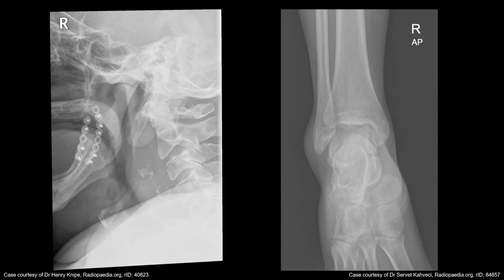On this slide on the left, we're going to look at the soft tissues and wonder, okay, what's going on here? There's a little bit of calcification here, but what's of real concern is the fact that the prevertebral soft tissues have a very large distance. You can see the trachea here is pushed way forward. This should be back here, and that's indicative of a soft tissue mass that needs scrutinizing. So we'd have to find out what's going on there.